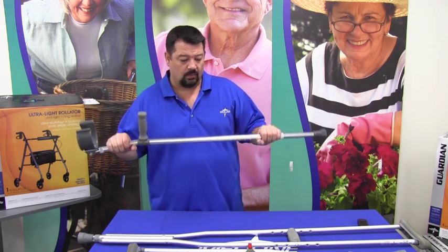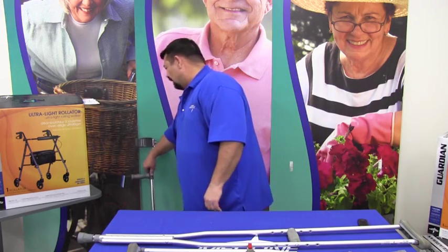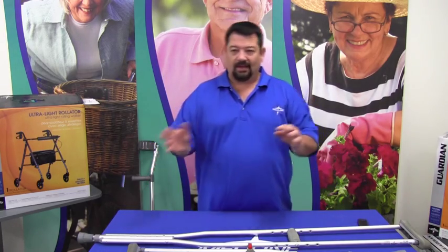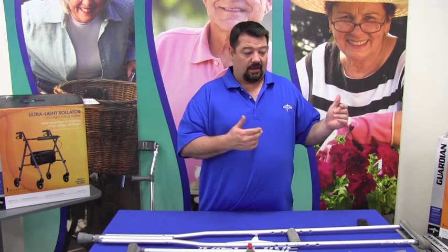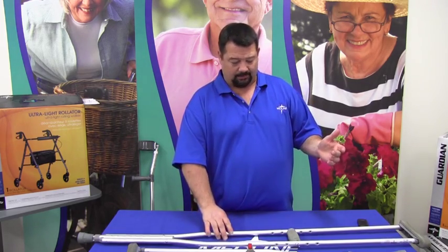Okay, now the next is going to be the axillary crutches. Axillary crutches are, out of all the crutches, the most common. There are different takes, different options on some crutches. They go from the basic to the extremely optioned, with all the attachments on it.